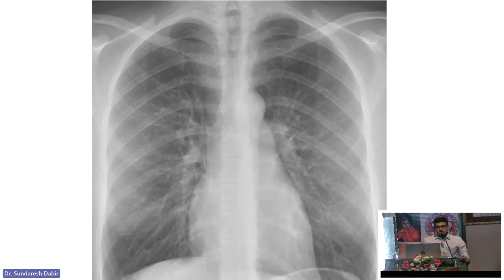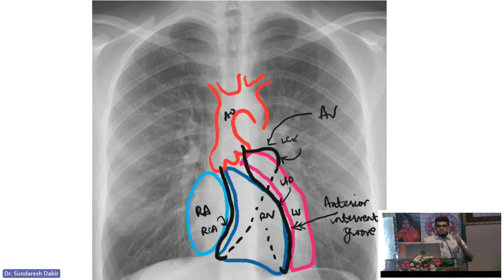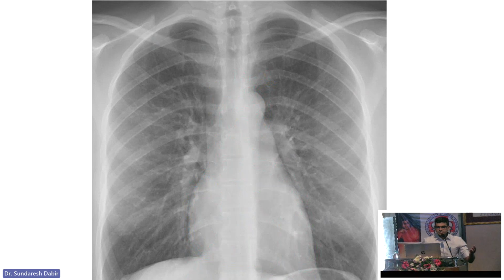Very important in coronary angiography is that we are all looking at an X-ray, and an X-ray is a 2D image, as I said. How do we superimpose cardiac structures on a 2D image? That is the fluoroscopic anatomy of the heart. That is important for technicians, because when I was learning my angiography, I was taught by technicians: sir, your catheter is already engaged, you're in the PA. How do you know that? You know that only if you understand the fluoroscopic anatomy of the heart.